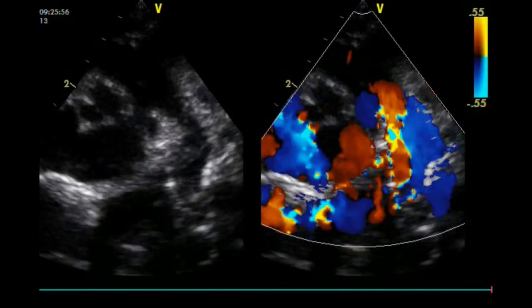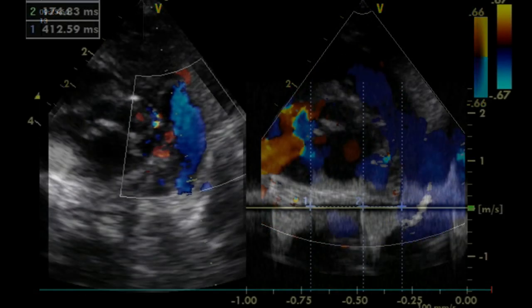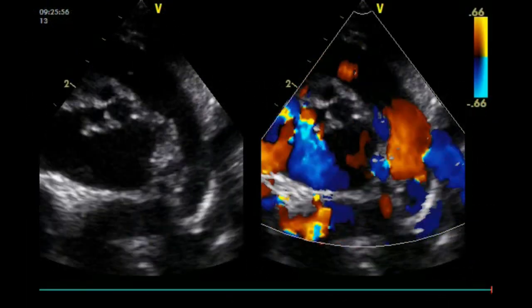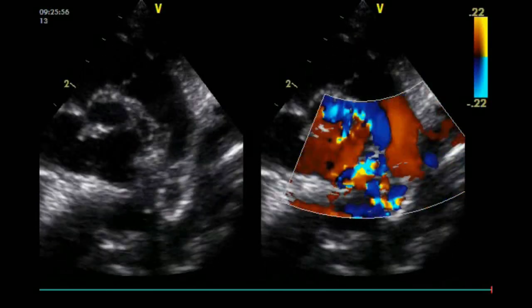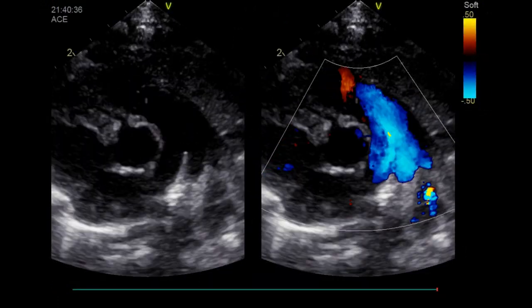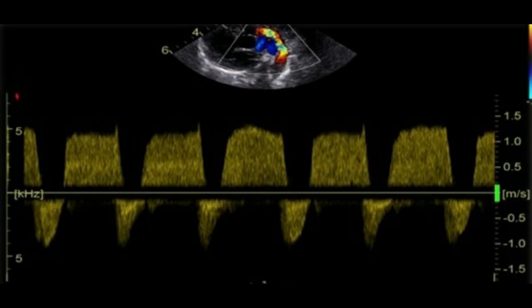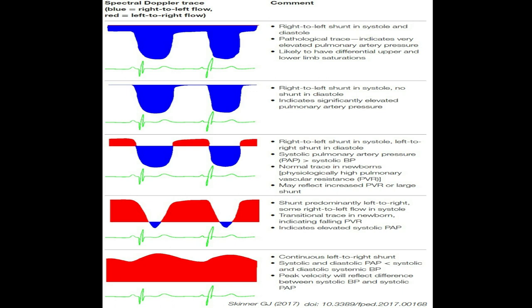A ductal right-to-left or bi-directional shunt is observed in 73 to 91% of patients with persistent pulmonary hypertension of the newborn. Transductal right-to-left blood flow can be used to estimate systolic pulmonary arterial pressure when it lasts greater than or equal to 30% of the heart cycle; however, measurement via ductal flow is often not reliable. The presence of a shunt between the systemic and pulmonary circulations allows estimation of relative pressures. Large, non-restrictive shunts without outflow tract stenosis result in equalization of systemic and pulmonary pressures, and the direction and quantity of flow will reflect the relative difference between systemic and pulmonary vascular resistance.